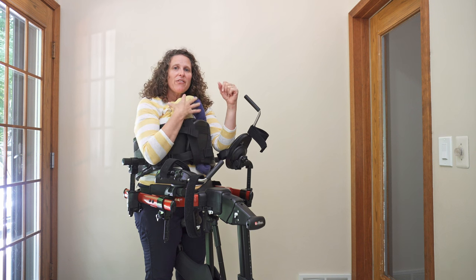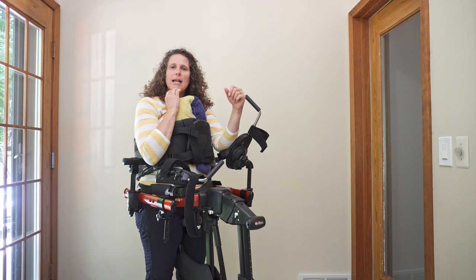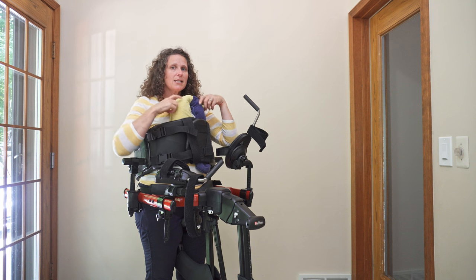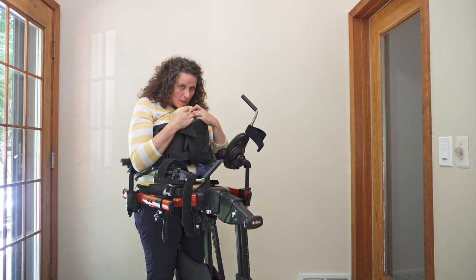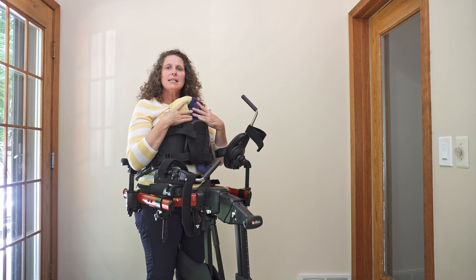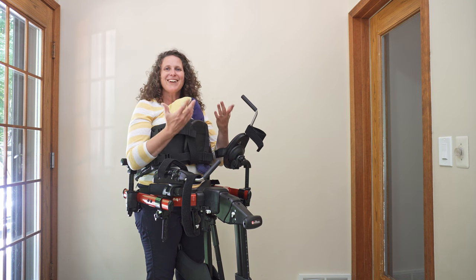You might also want to consider using a neck collar, but if you don't have one available or if it's too much support, you can decrease the support by pushing this down more, so then they have to work a little bit harder. It's a really nice, easy, simple little way that you can help give them support and then also reduce that support as they get stronger.